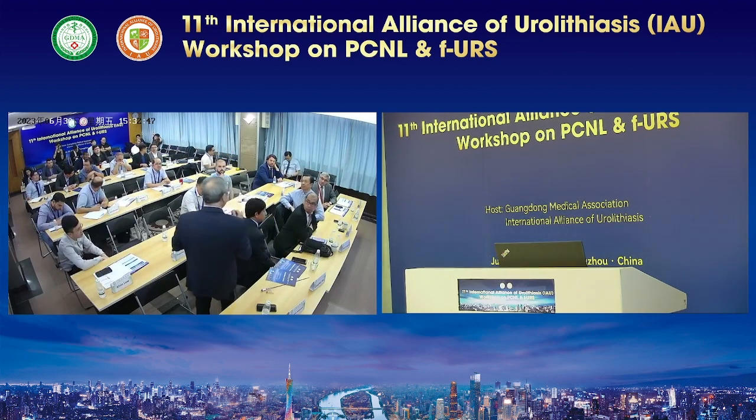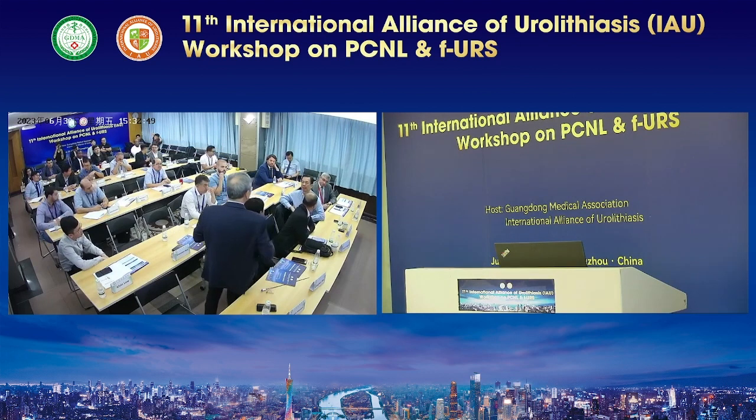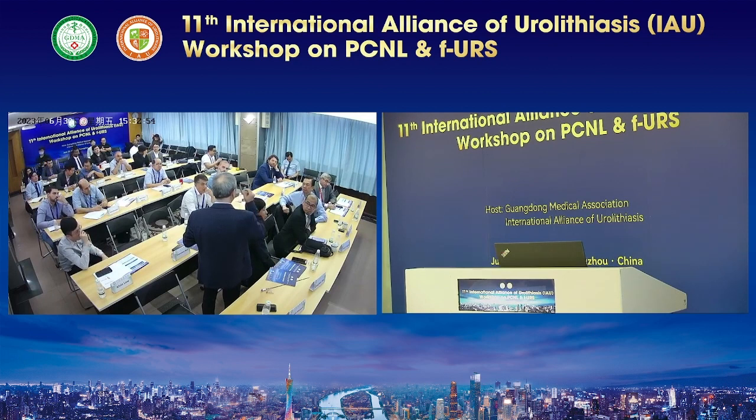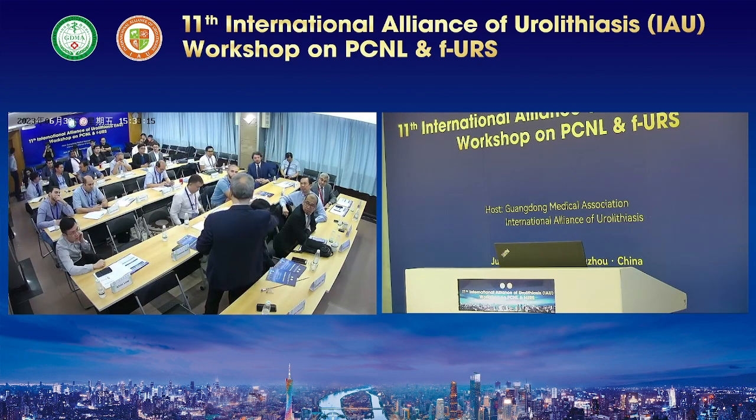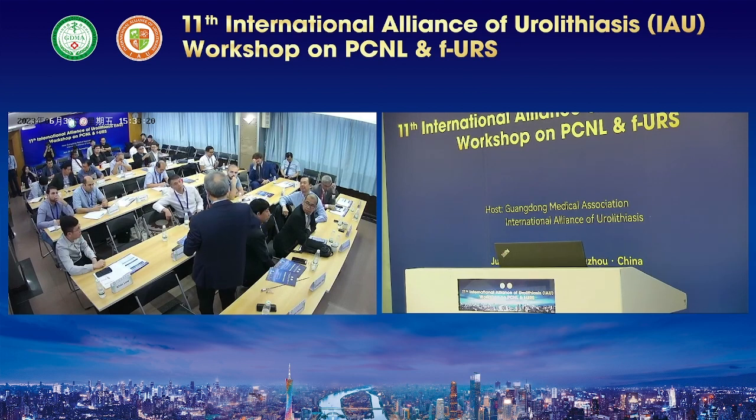But Sam, do you do multiple axis PCNL? I do. Yeah. For me, I usually puncture the first, and then I check, remove a stone, and then my scope can notice after this calyx stone, maybe. But sometimes many urologists do puncture at first, put a guidewire, and puncture at the same time.